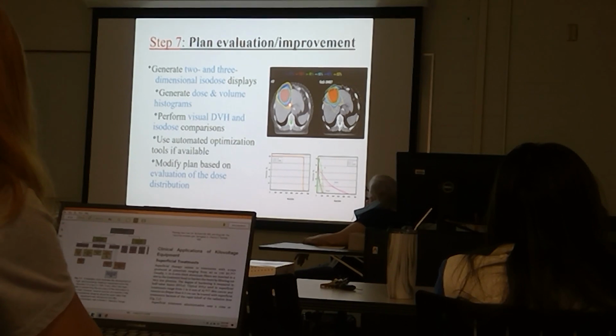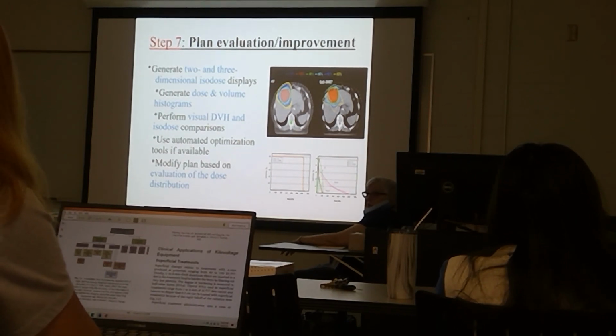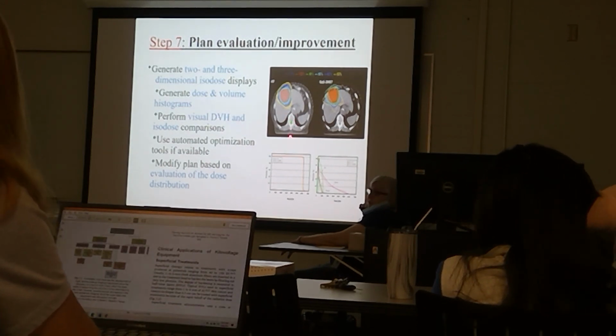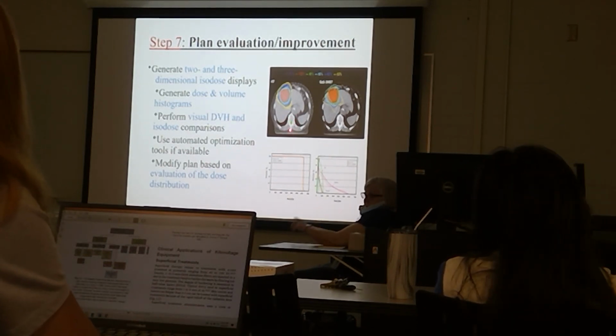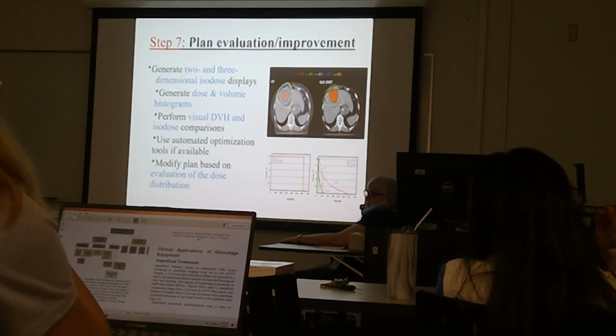And we have a problem here. Look at this. What's this? Spinal cord. Should it be getting 95% of this? No, definitely not. You'd get shot if you showed that to the doctor. If this is true, if this is just not a computer glitch.